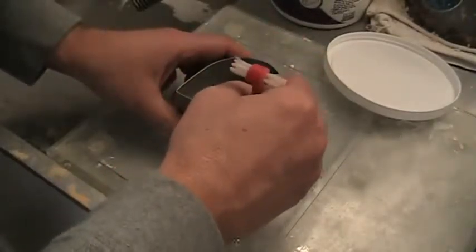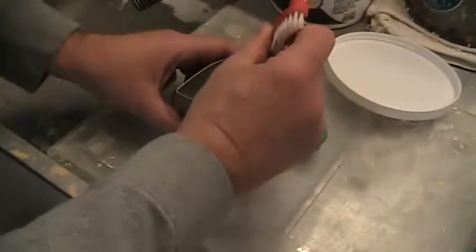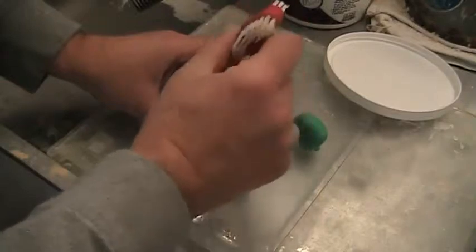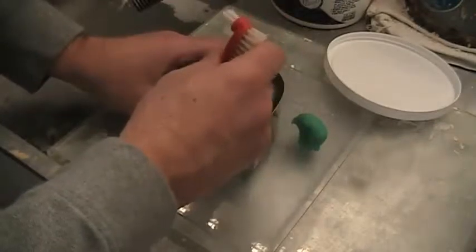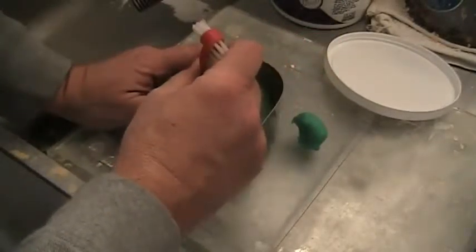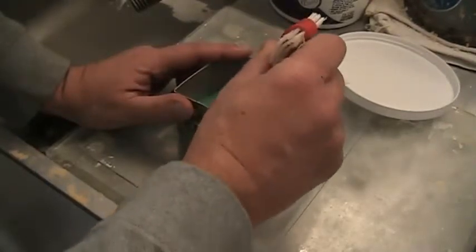I'm going to take my little handle and push the Wonderfill material up against the bar so that I don't get any flashing of stone, because what I'm going to do next is mix up some stone and pour it in here. And that's about it, just backfilling a little bit on either side, making sure there isn't any way that stone can creep around my junction of the Wonderfill material and the actual wax-up.